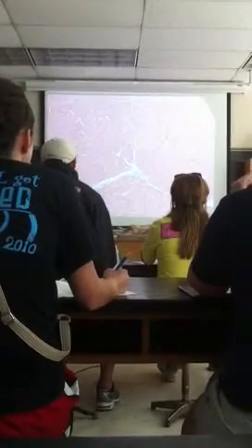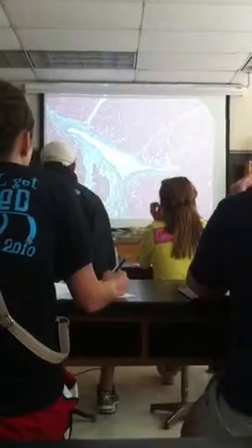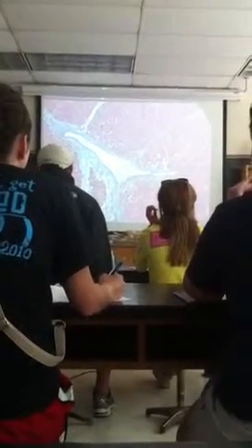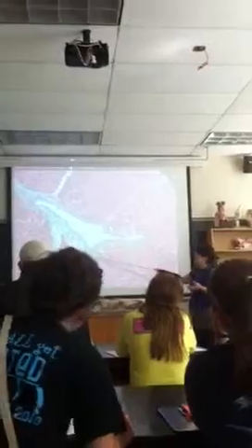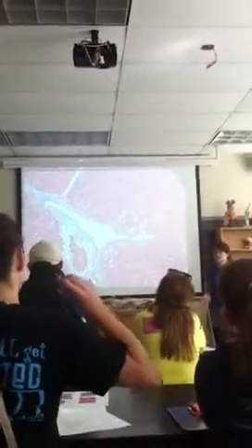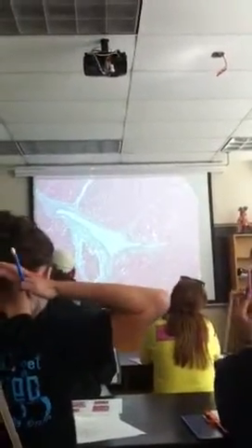Let me see if I can find a smaller one that's all right. It's over this way. I like that one personally. There's another portal triad, another portal triad. Here would be another one of those central veins. This one's not as pretty, but it's all right. You can see it's huge, right? Fairly thin, smooth muscle wall, and as you can see, there's not a bile duct or an arteriole associated with it. It stands alone.